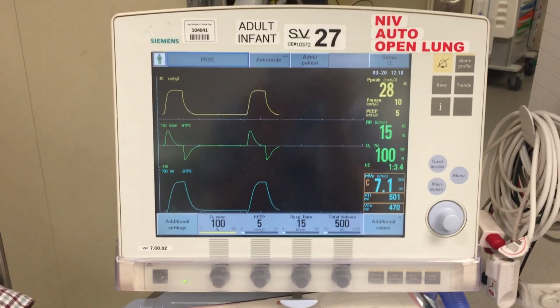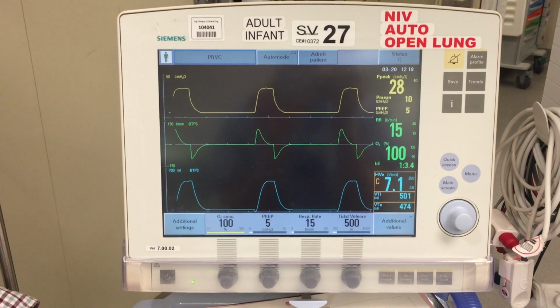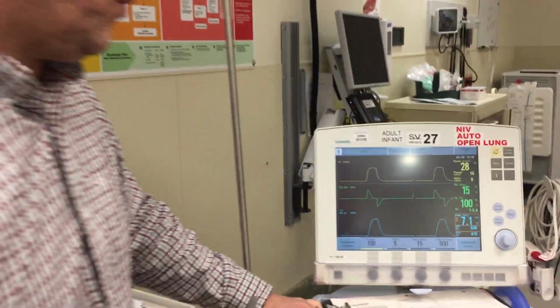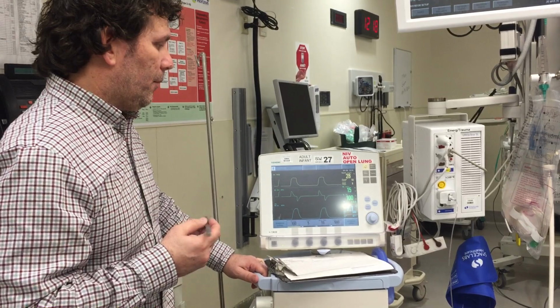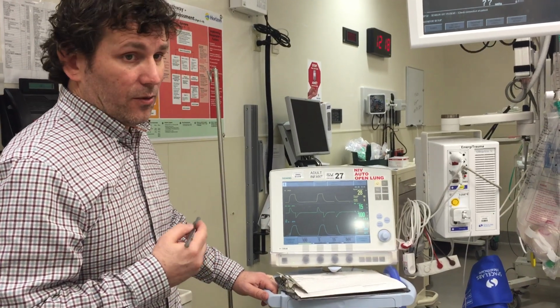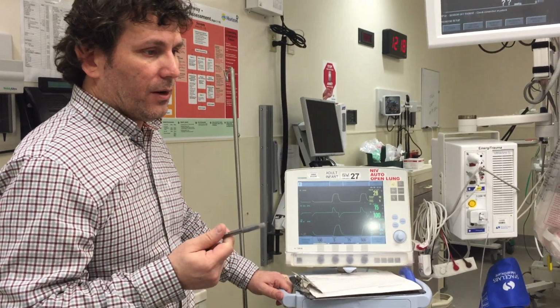Usually in increments of, initially I would just go in increments right up to 10, and then you would increment it 3 or 4 at a time, and then titrate. And of course, one of the most adverse things is hypotension, and pneumothorax can result if you get too high. But you're essentially at this point just trying to keep your patient alive and get as normalized ABGs as you can. Your rate is going to be used for anybody who's hypercarbic.